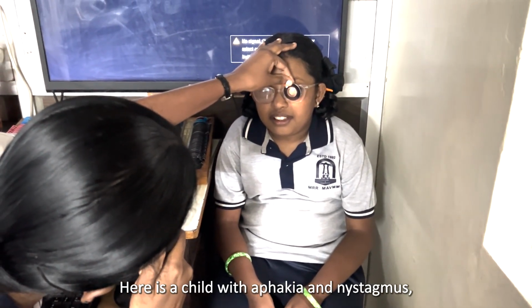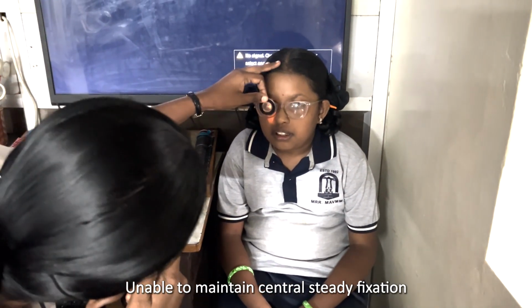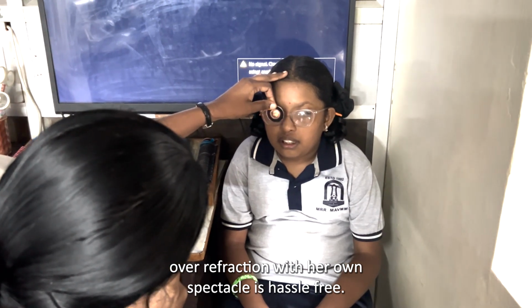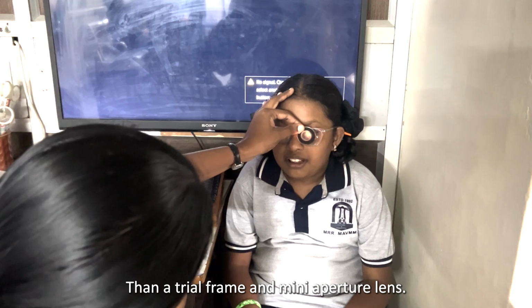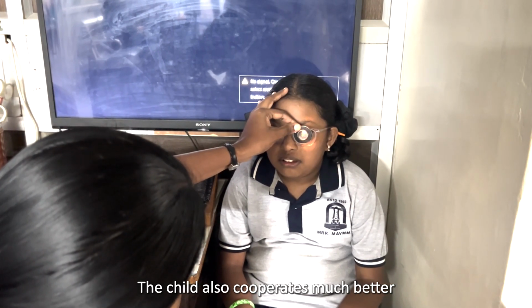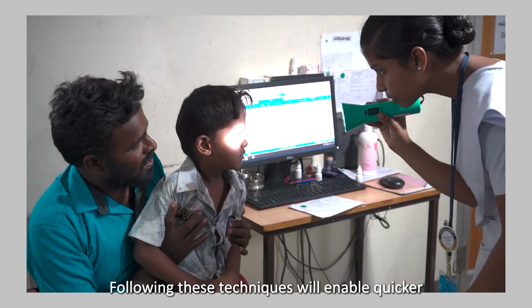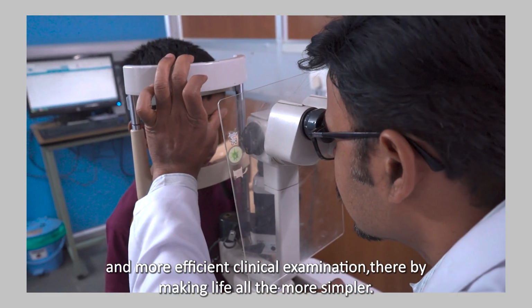Here is a child with aphakia and nystagmus, unable to maintain central steady fixation. Over refraction with her own spectacle is more hassle-free than a trial frame and mini aperture lens. The child also cooperates much better. Following these techniques will enable a quicker and more efficient clinical examination, thereby making life all the more simpler.